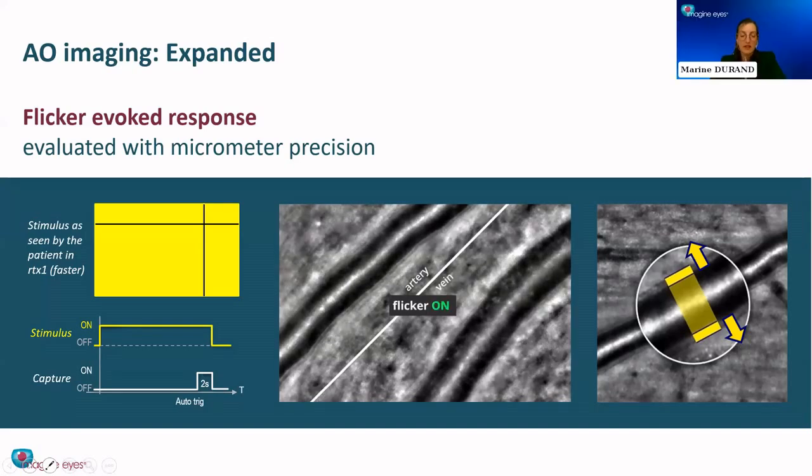So these are very interesting perspectives that you are explaining to us today about what RTX1 adaptive optics imaging and this new possibility to stimulate the eye before acquisition might enable in the future in your research. So thank you very much for sharing that with us today. As you saw, we have added more functionalities and imaging modalities with this TFI illumination we presented at the beginning to the RTX1 device.